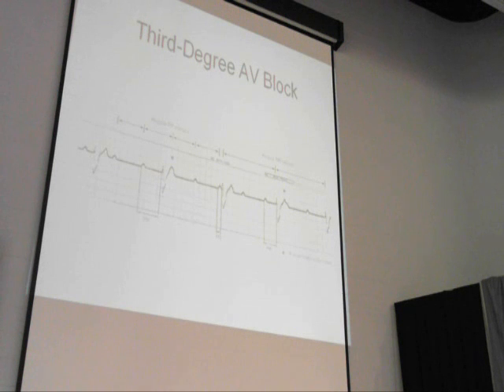In the olden days, it was called complete AV dissociation. Atrioventricular dissociation. I don't really have a problem with that name.